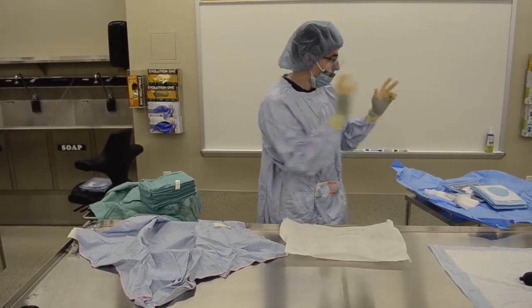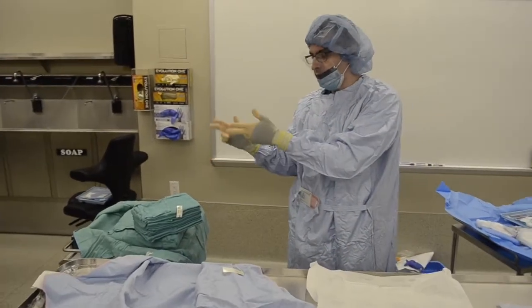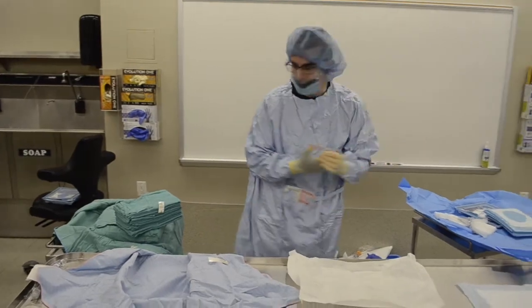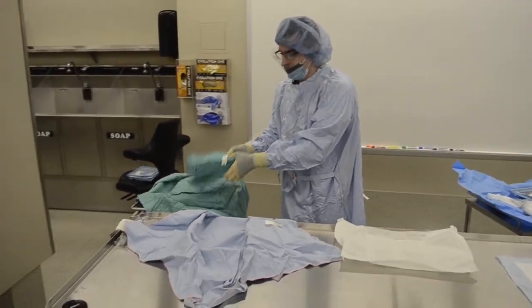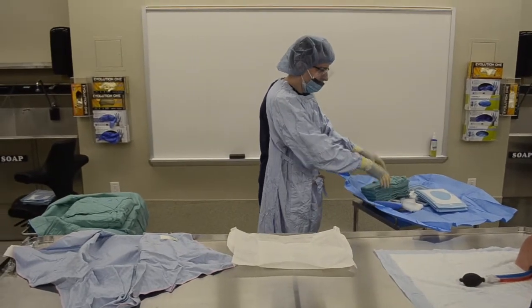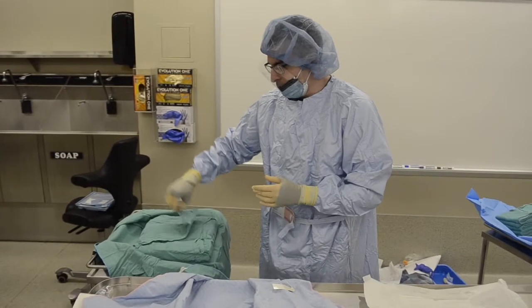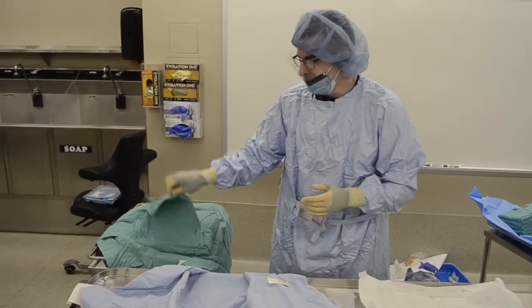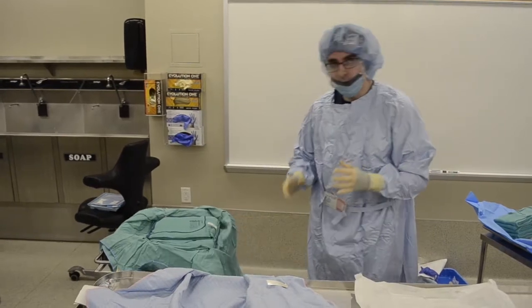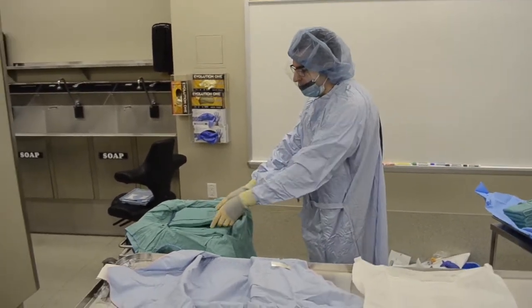Now we're sterile. We can now touch the inside of the kit. We can touch where our towels and our drapes are. So we're ready to drape the patient. I'm going to move my towels out of the way. You can then flip this over. And this is unique to Herman. We have this towel and drape kit.